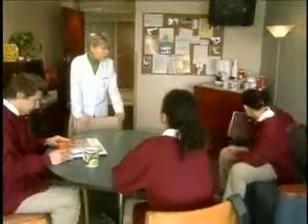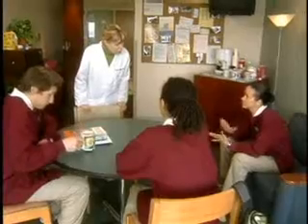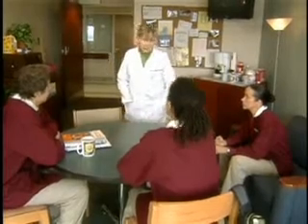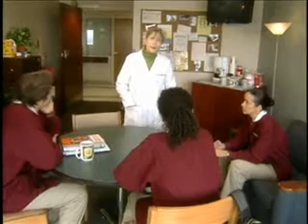Morning, everyone. Okay, today I'd like to talk about issues relating to oxygenation. Can anyone tell me what a pulse oximeter is? A pulse oximeter is a device that determines the amount of oxygen saturation of arterial blood. Good. When could it be used? Well, a physician might order a frequency or parameters for checking a patient's oxygen saturation. Good. Any other time? Okay, well, it's also an intervention that can be used according to nursing judgment and facility policy. Now, the accuracy of the reading can be affected by alterations in circulation, movement by the patient, and substances such as nail polish or artificial nails. Really? Yes, depending on the particular model of the oximeter being used.